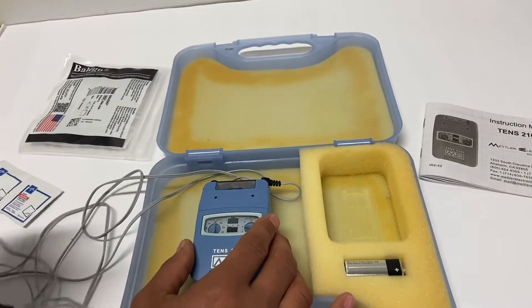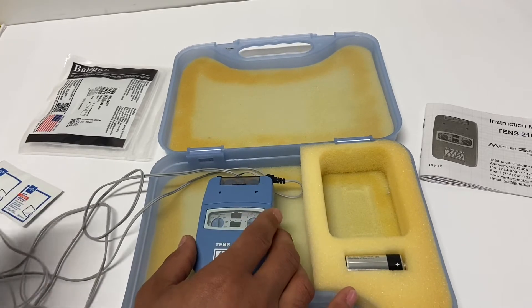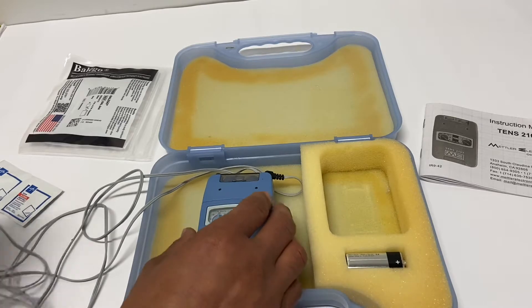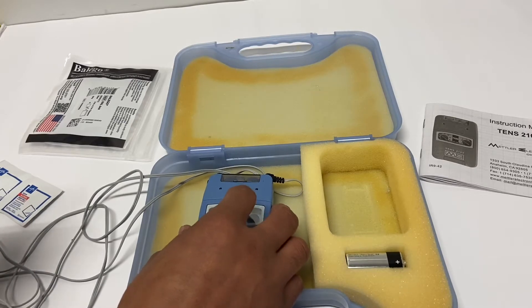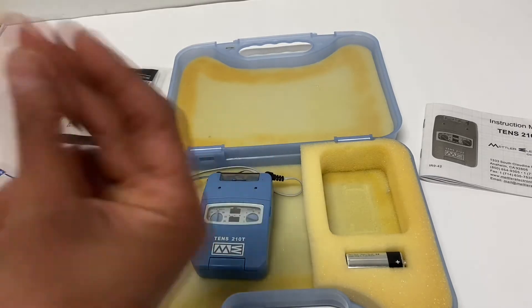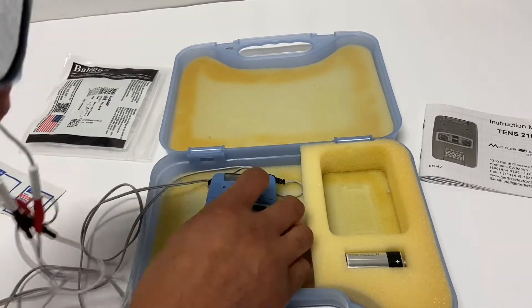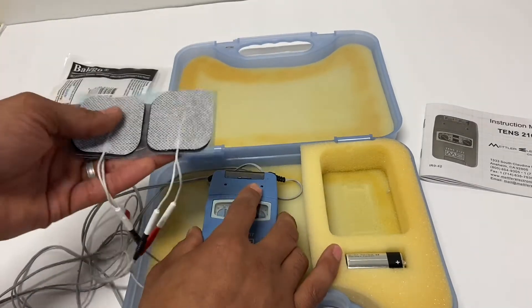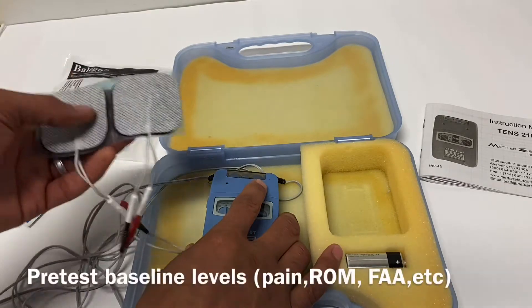For example, I go through: any history of seizure or epilepsy, any active cancer that you're aware of, any pacemaker, any aversions to electrical therapy. I like to have a nice order so I know I'm not missing any. Next, for pre-test, we want to test the resting level of pain and also the location.